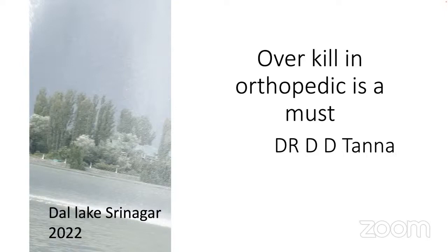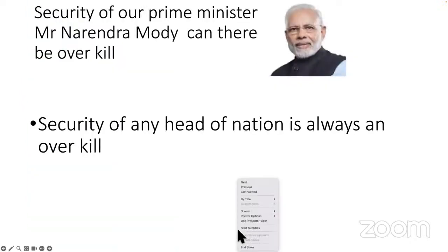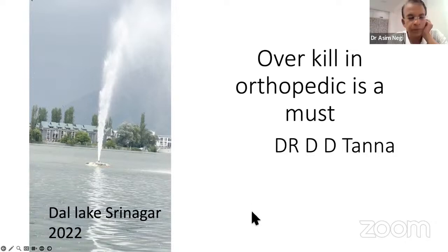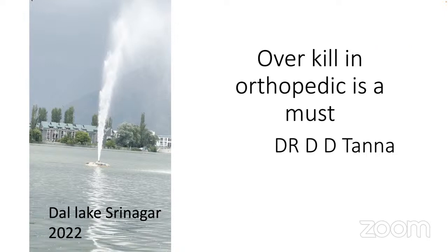Actually, now for the majority of people the cavity is changing, so I use mostly a 10 mm nail for the tibia. After reaming, I ream 11 and put 10. If I put a 10, then I put 9. So now in the majority of my cases it is 10, 80%, and 20% is 9 in practice.